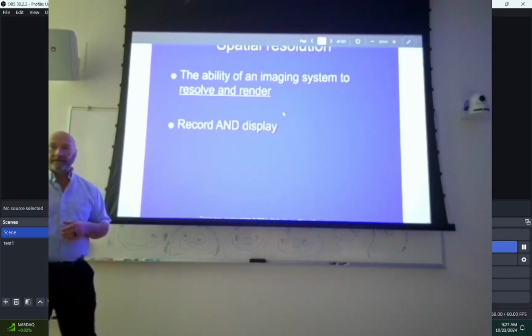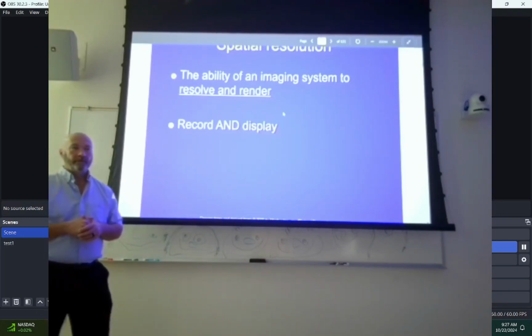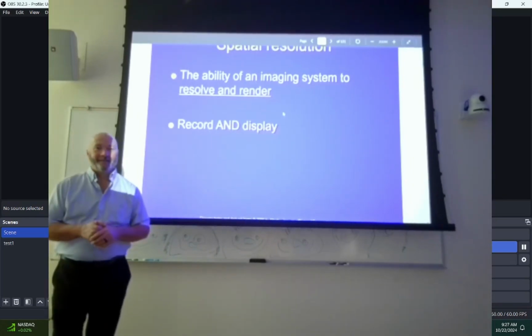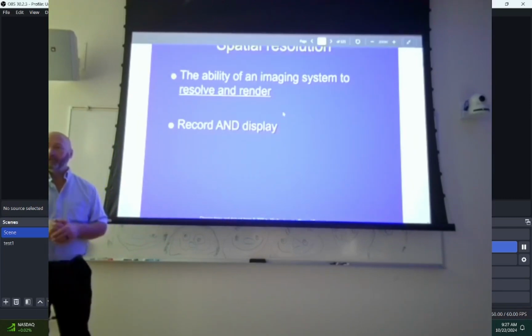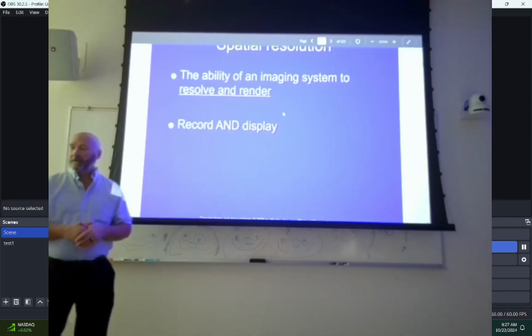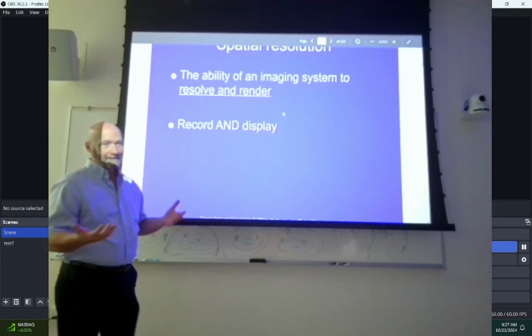And it's kind of like a TV. With a TV, how do you measure resolution in television? Or a computer screen, your phone. Come on, y'all know this. You got two sets of numbers, right? Two sets of numbers that basically give you a number of pixels in one dimension versus a number of pixels in another dimension. And your image receptors are basically the same thing.